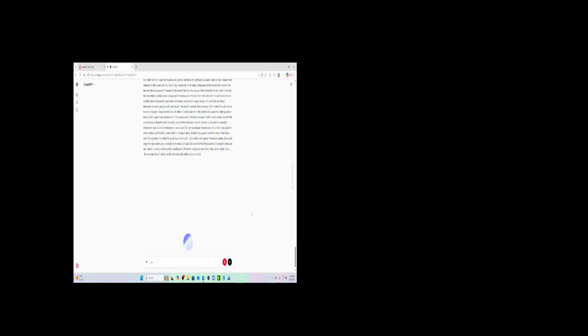Section 2.36 is on rubber base materials. Rubber base impression material is supplied as a base and a catalyst. It's accurate, durable, and has good elastic properties. It's not very pleasant to work with and will permanently stain clothing. It's used for complete dentures and fixed prosthetics.